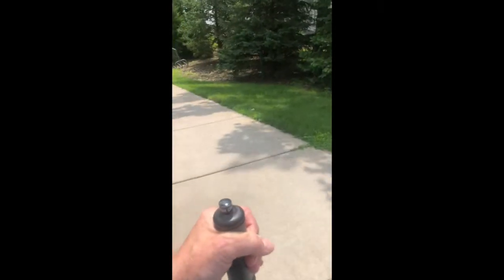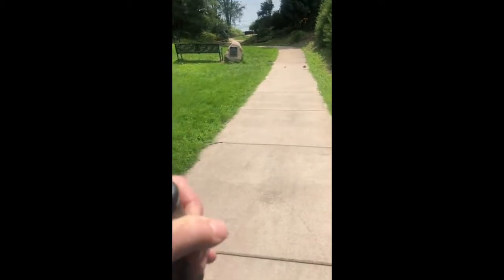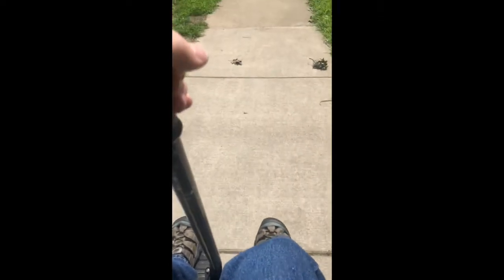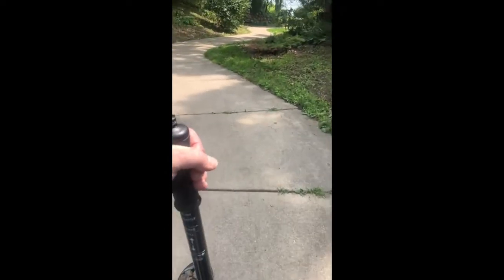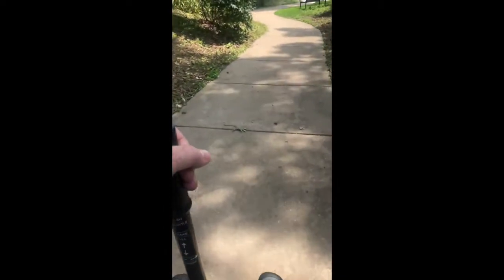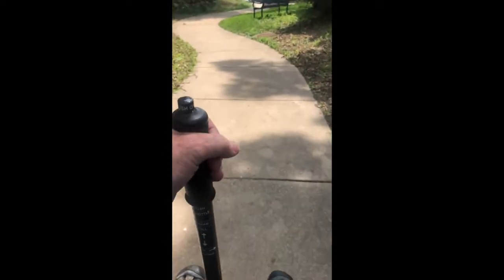Taking it nice and slow, using the power braking mode of the Segway to slow us down. We're going down at a very controllable pace. No worries — very good control. The regenerative braking is utilized here, so it's actually probably charging the batteries as we go down this incline, because I'm using the reverse braking mode to slow it to a crawl.